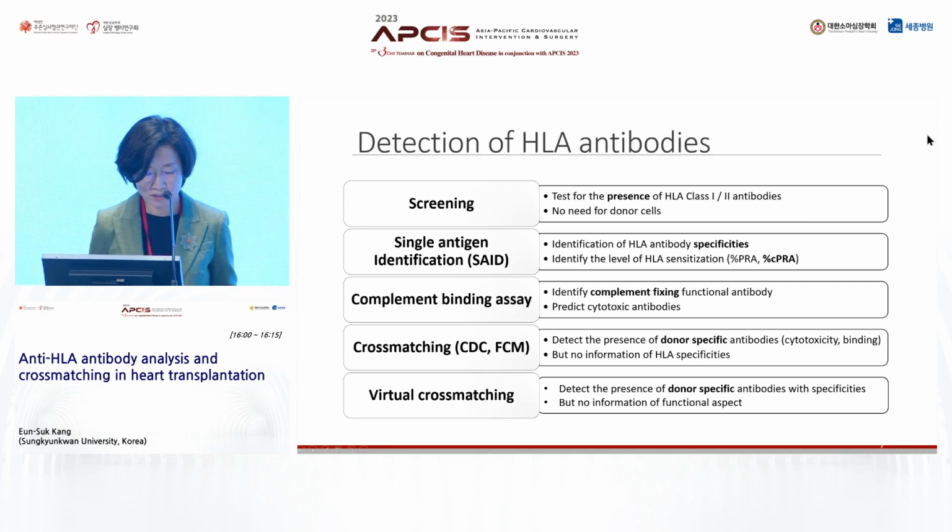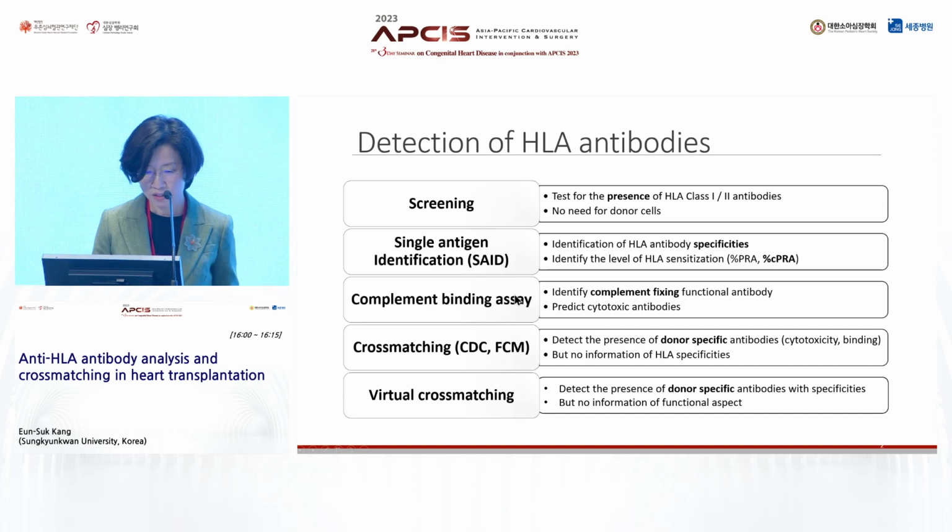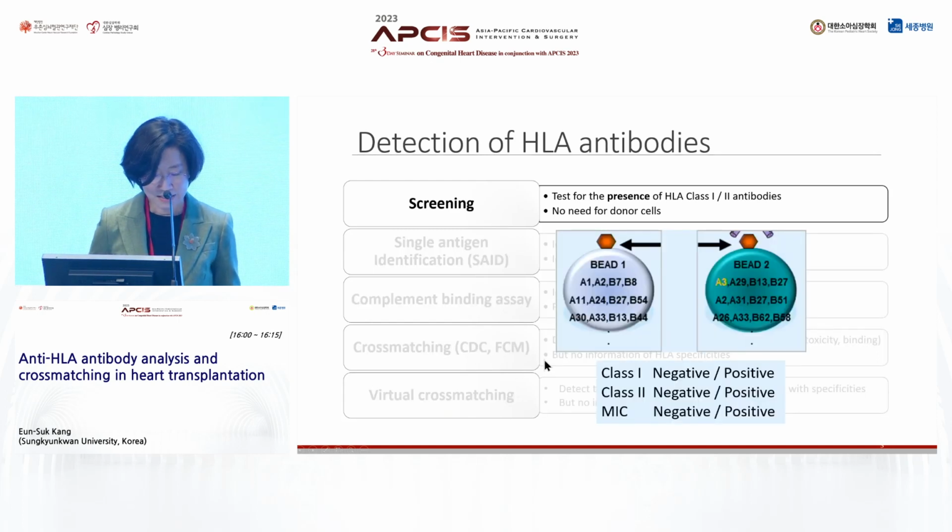These are the current tests and concepts used to detect HLA antibodies, whether donor-specific or non-donor-specific. The test methods include microbead-based immunoassay, cell-based functional or binding assays, and the virtual cross-matching of histocompatibility. Essentially, a screening test is designed solely to determine the presence or absence of HLA antibodies in patients.